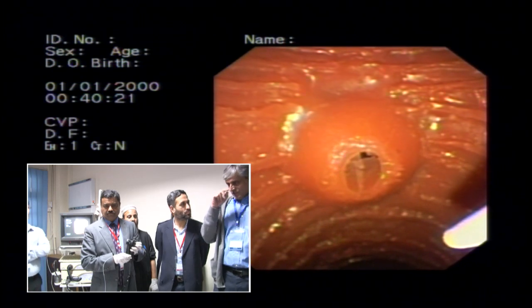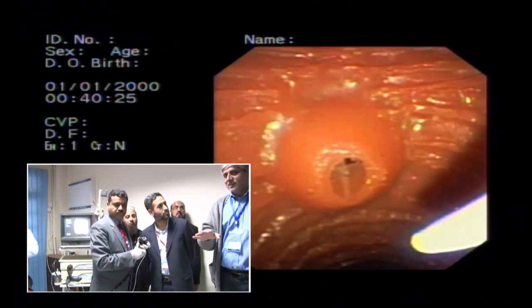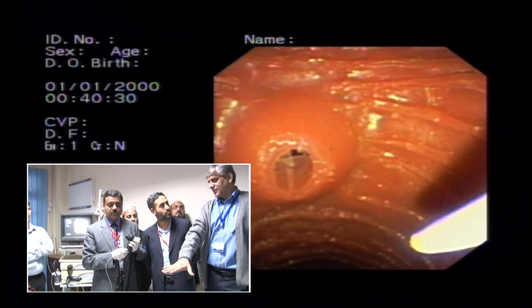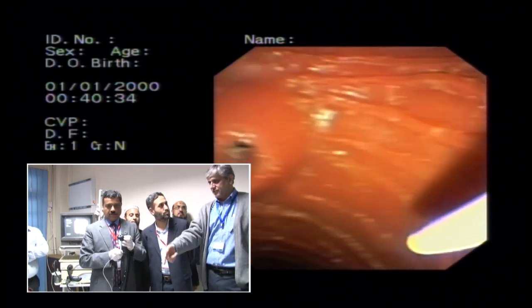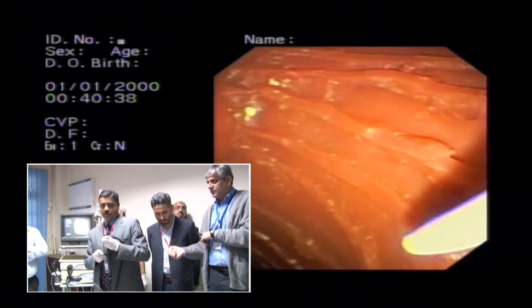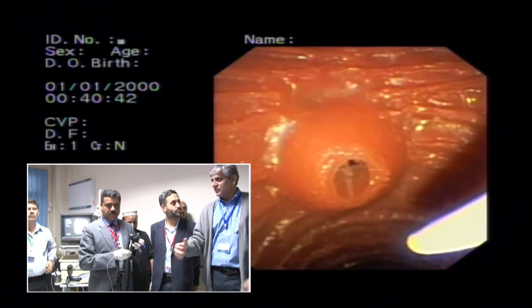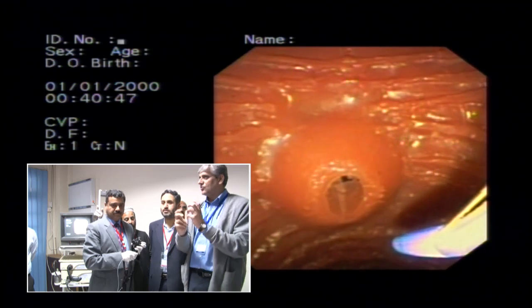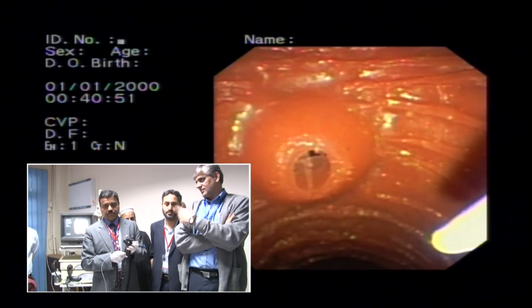And what we will do is when we go on live cases, you get a chance to do not so much because it's not fail. The reason for keeping this is that you can do this. We'll also give you practice with stent exchanges on this, no problem. We can do it six times, draw all the things. But the concept should be built from here. We don't want to sit with the patient and show you, keep doing this or try this. You want to do it but subtly, because you don't have a lot of time.